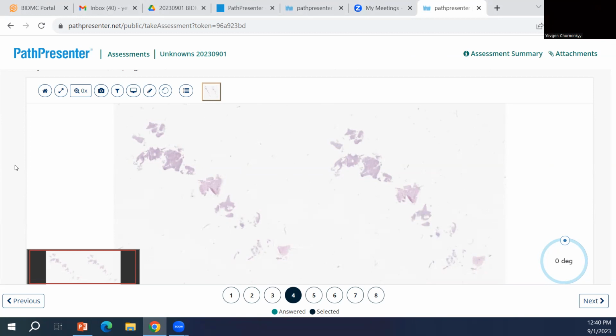We got in a lot of trouble with some cases, because some people would call it something. And sometimes they'd be right, but sometimes they'd be wrong, because with spindle cell, you need molecular, you need IHC, and then everything looks like everything. So I think they just made it policy to defer to permanent, and the surgeons are okay with that. They know that we can only go so far.